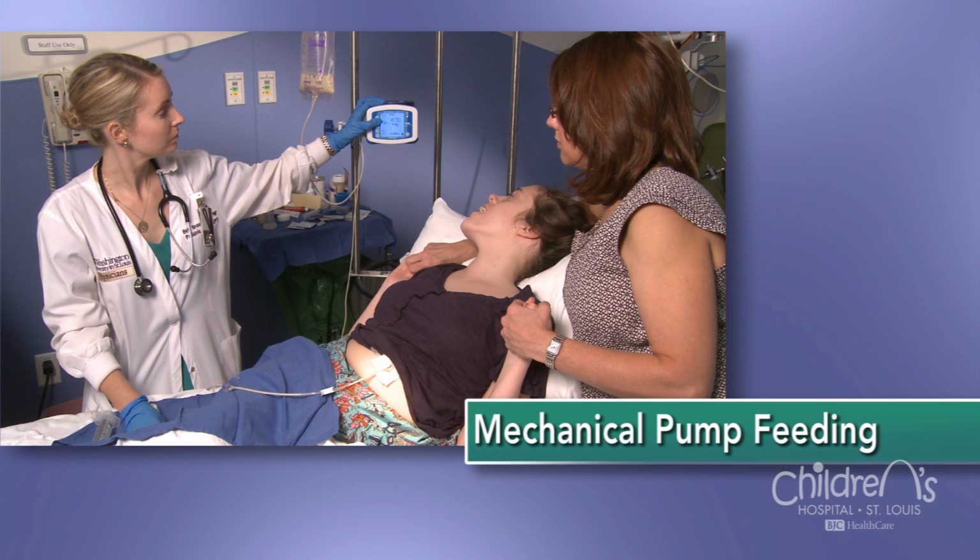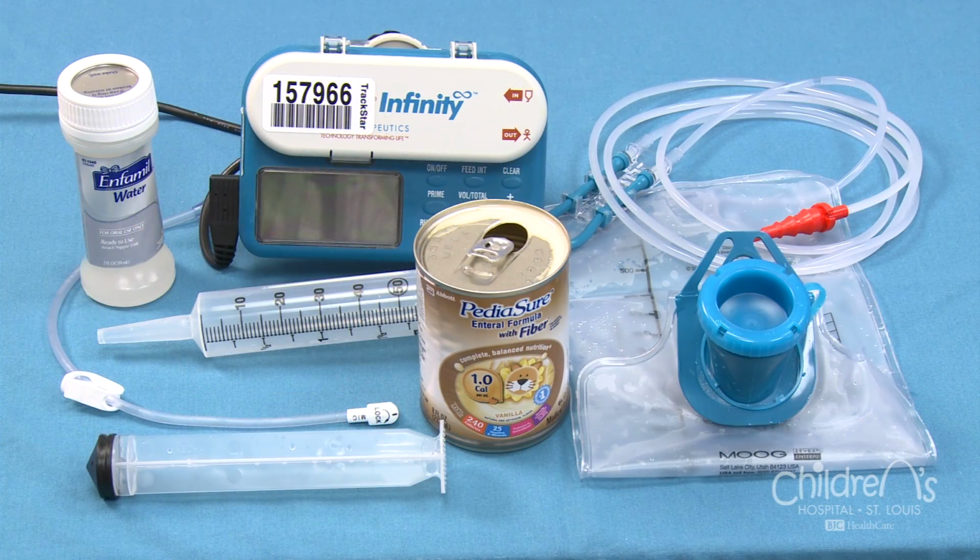Feedings delivered through a mechanical feeding pump can be continuous during the day or night, or they may run over several hours. To deliver a feeding using a mechanical pump, assemble your supplies first. You'll need a feeding pump, tubing or bags, formula, feeding syringe without plunger, and water for flushing. Once you've assembled your supplies, follow these steps.